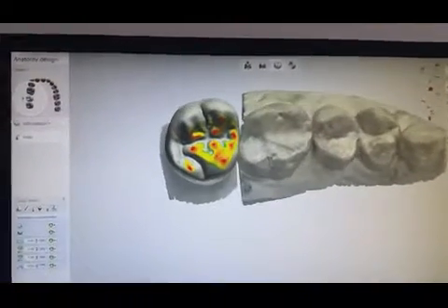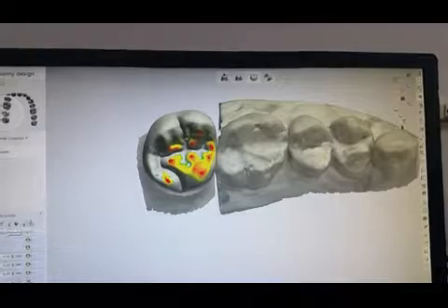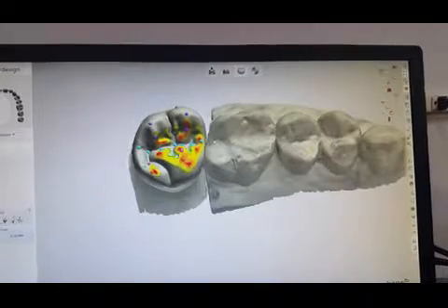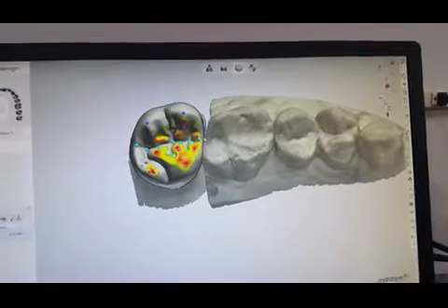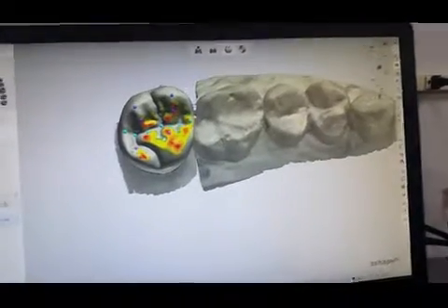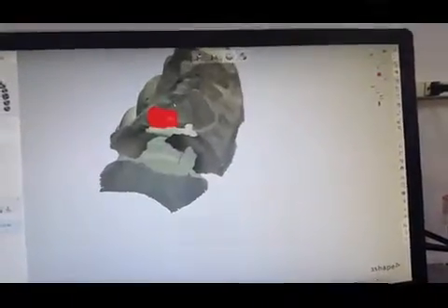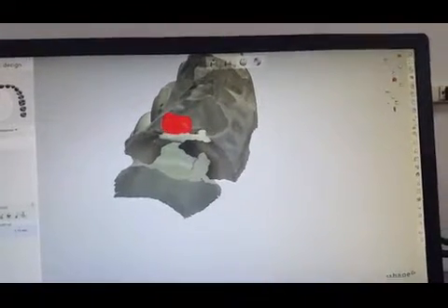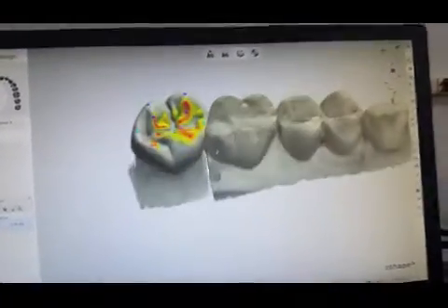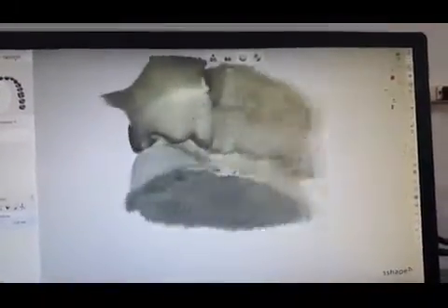because most of our accounts don't like pinpoint contacts. These are real cases, so I have to proceed with that, because a lot of our accounts, I'm sorry, like broad contacts. Not necessarily tight, but broad. And we can look here, and this is how broad it is. This is where the redness is. Now, red means it's hitting heavy, which I can clear later. I just want to make sure for now I have that contact. We'll put the opposing on there, see where we're at.